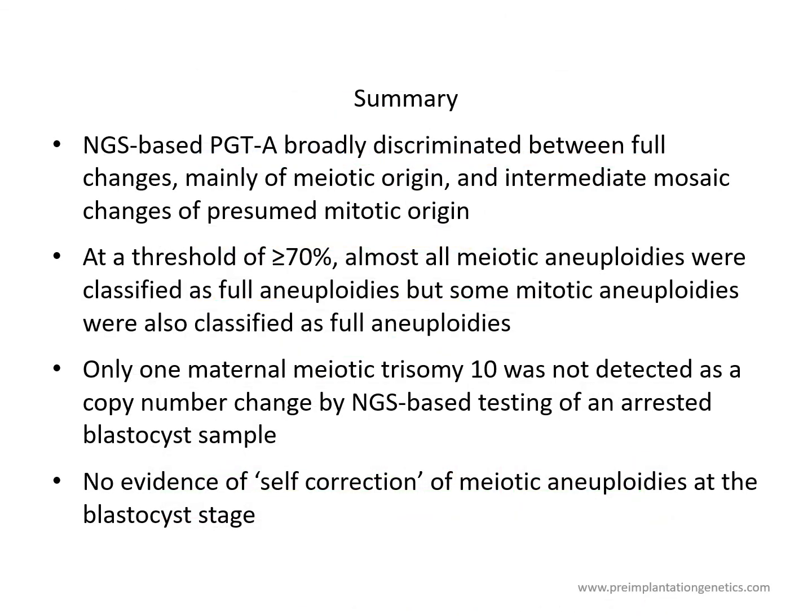So in summary then, NGS-based PGT-A broadly discriminated between full changes, many of meiotic origin, and intermediate or mosaic changes of presumed mitotic origin.